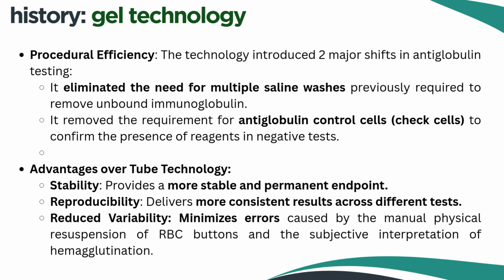So now let's highlight the advantages of gel technology over traditional methods. The gel method provides a more stable and permanent endpoint, and it ensures that our results are not only reliable but also easier to interpret over time. And moreover, gel technology enhances reproducibility. So it offers consistent results across different tests, which is crucial for maintaining quality and reliability in laboratory settings.